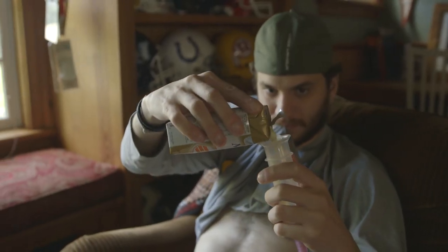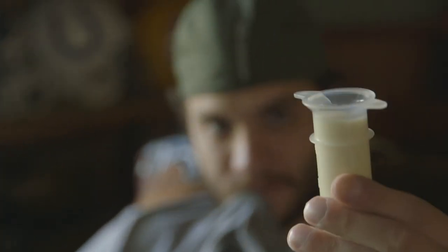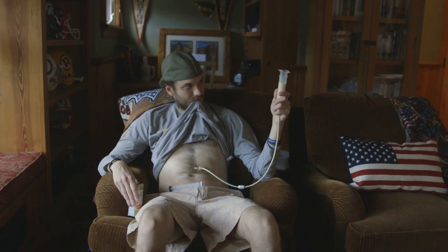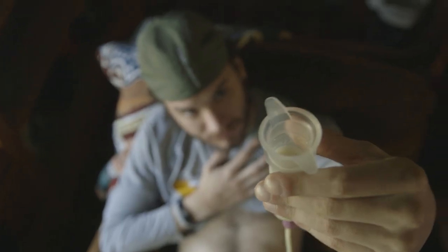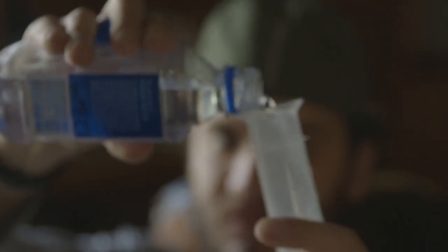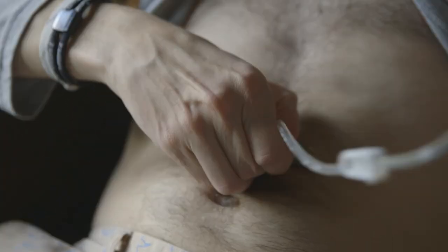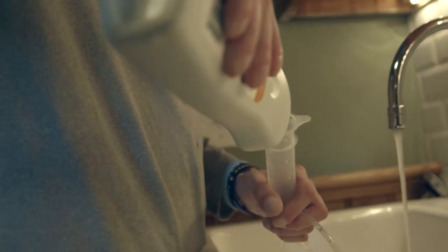As a side note, it may also be easier to first pour the formula into a measuring cup with a spout before pouring into the syringe to prevent spills. You can change the angle at which you hold the syringe to increase or decrease the flow. Once you have completed the formula, flush with water, then clamp the extension set, disconnect, and close the button. You may wash your feeding tube supplies with warm water and soap after use.